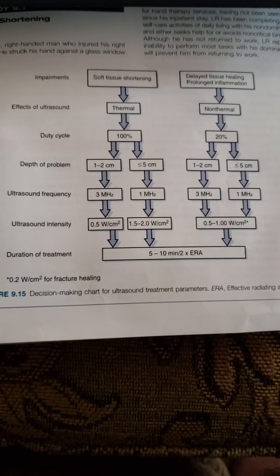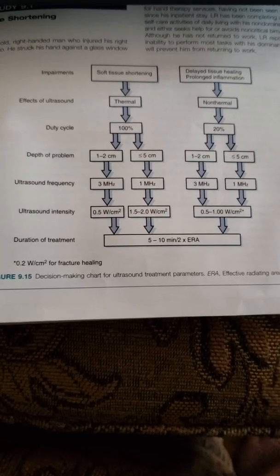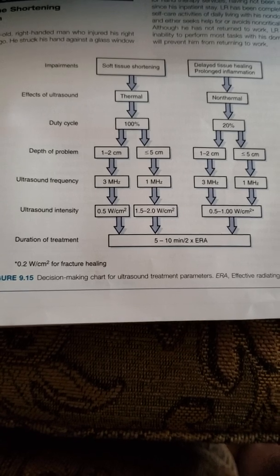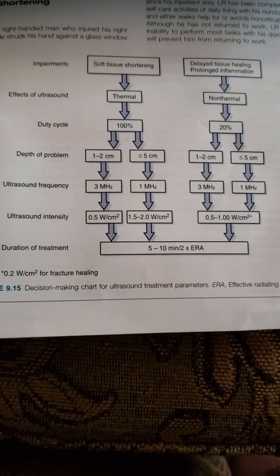Okay, today we're going to be talking about ultrasound, and here's a chart that I'm going to be providing everybody after this presentation in regards to ultrasound. And just like it says, it's a decision-making chart for ultrasound treatment parameters.